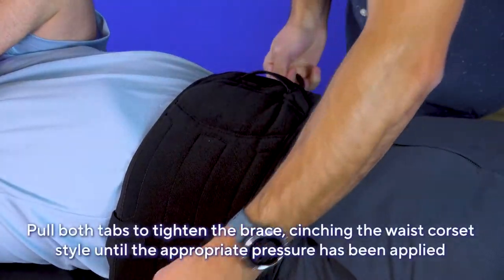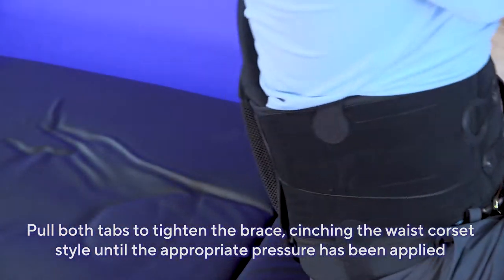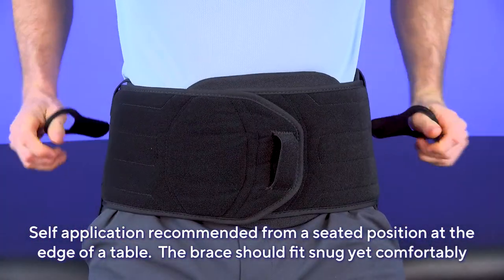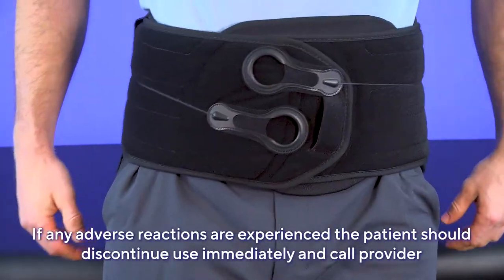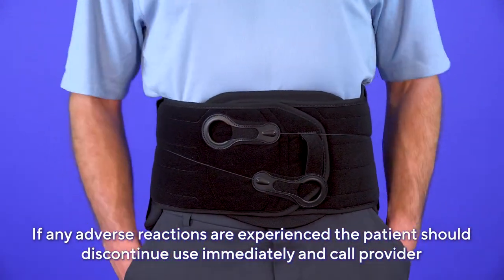Tighten the brace by pulling both tabs, cinching the waist corset-style until the appropriate amount of pressure has been applied. For self-application, the patient should be in a seated position at the edge of a table. The brace should fit snug but comfortably. If any adverse reactions are experienced while using the brace, the patient should discontinue use immediately and call their provider.